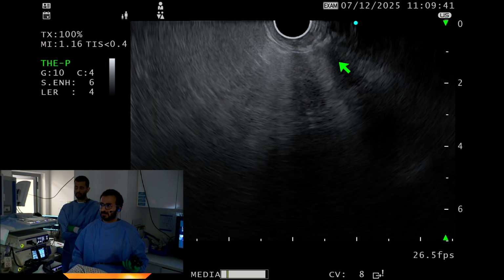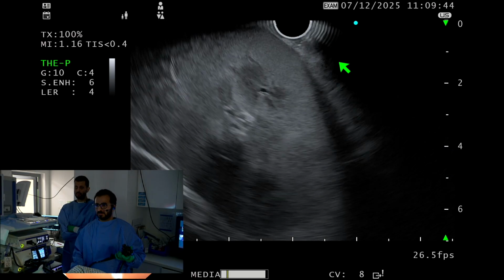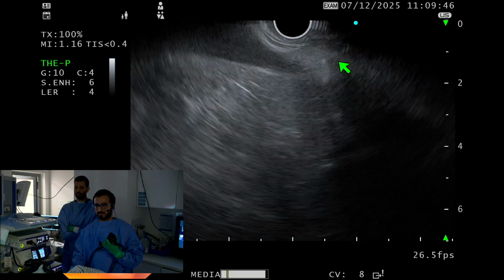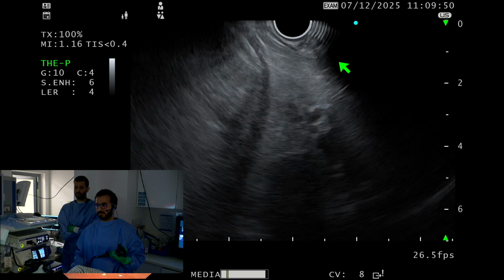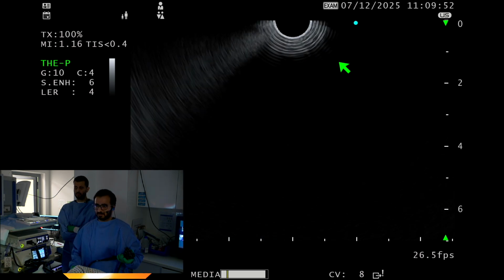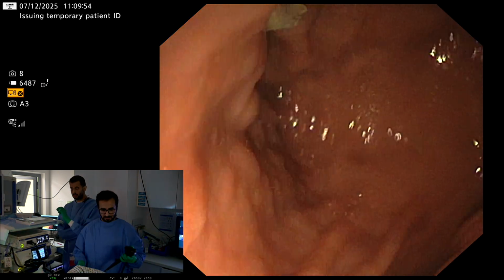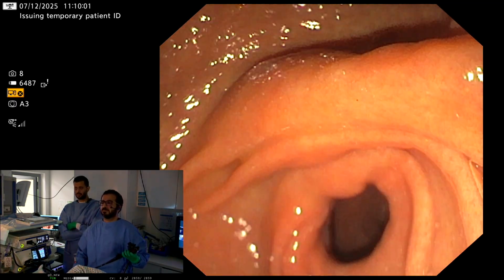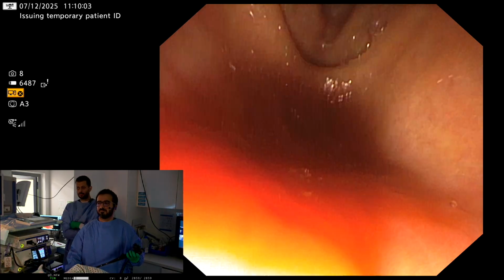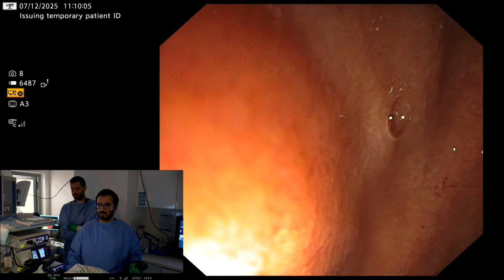So that's one comment. But having said that, I think we see these images very nicely. The second comment, and the technique of demonstration was amazing, is that cross-sectional imaging often will report the lesion to be in the body when it's near the head and neck area. It will report it in the head when it's actually in the uncinate. So only at the EUS will you find out what actually is going on. Third point, I agree, the parenchyma here looks a little bit lobular.